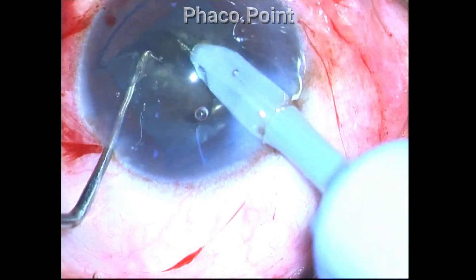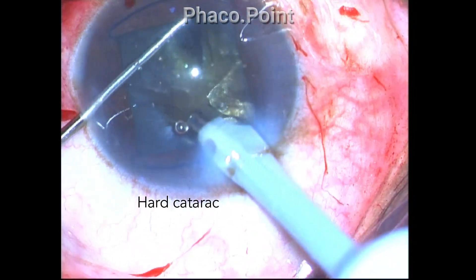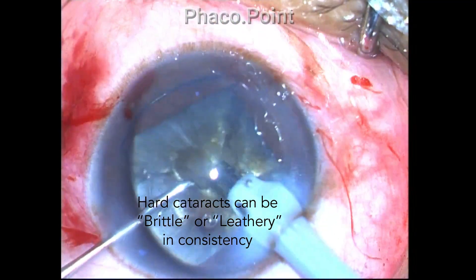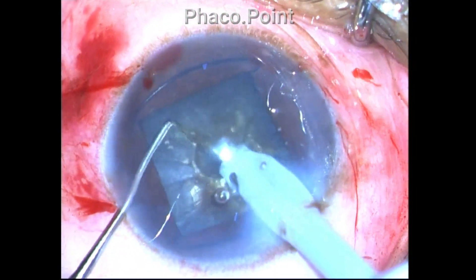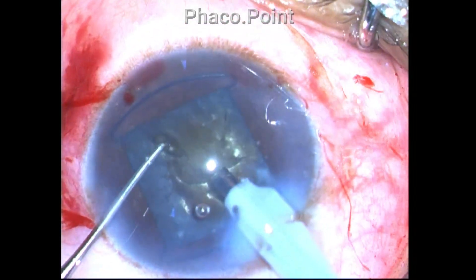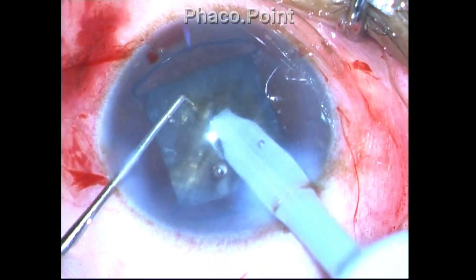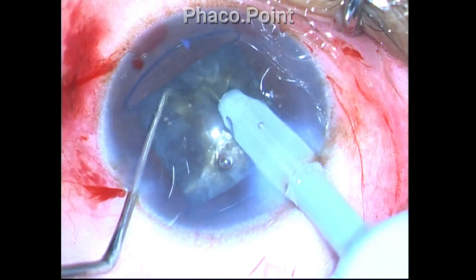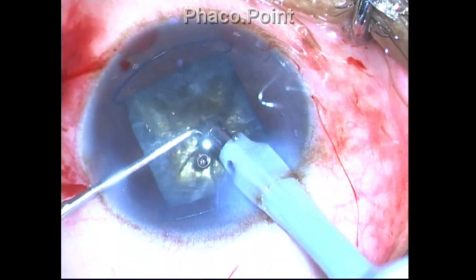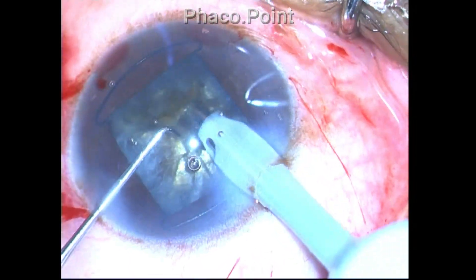Even when nucleus sclerosis is grade 4, 5, or 6, there are two variations in consistency: brittle cataracts, which are very easy to chop, and leathery cataracts. The leathery nature is due to accumulation of certain crystallins within the lens, giving a gummy consistency. In a leathery cataract, even with adequate depth, significant lateral force is required to effect separation. In this grade 4 case, separation looks simple mostly because this is a brittle rather than leathery cataract.